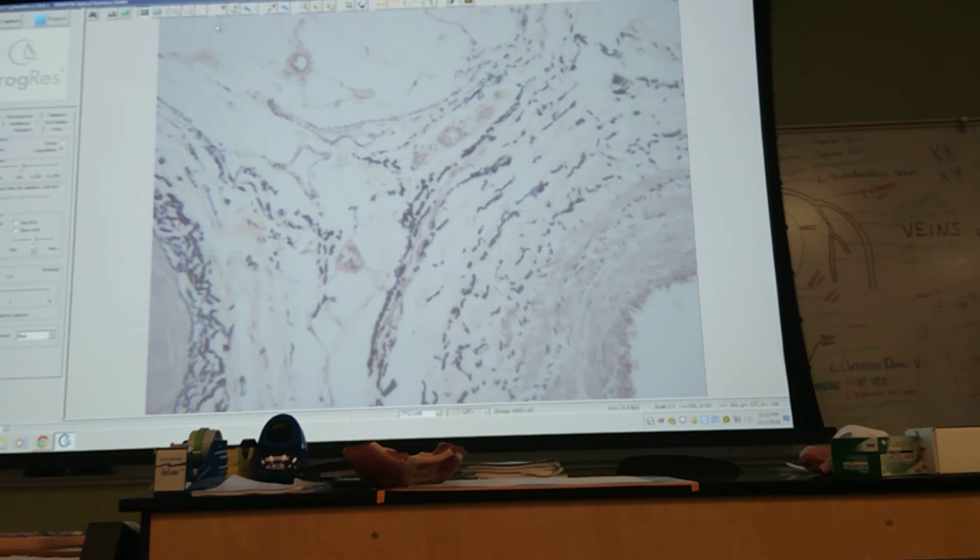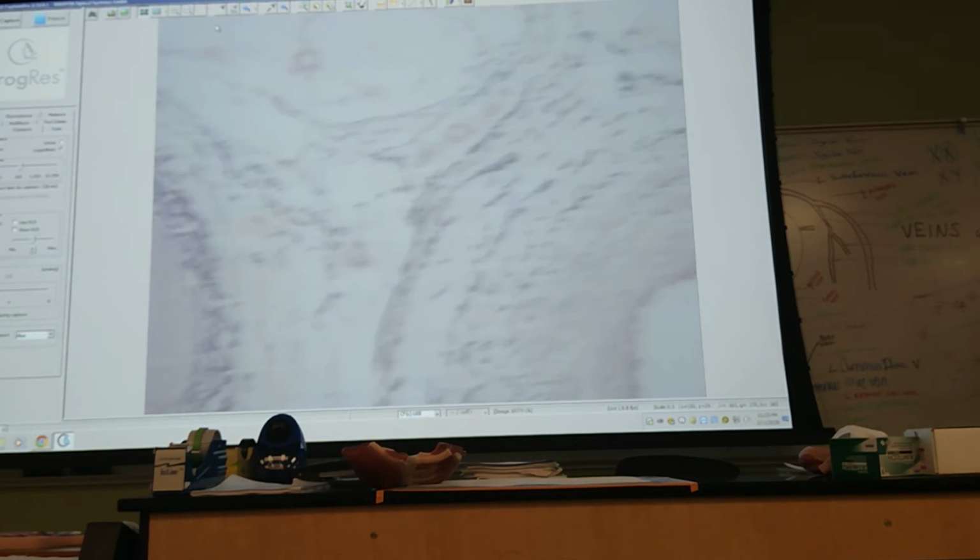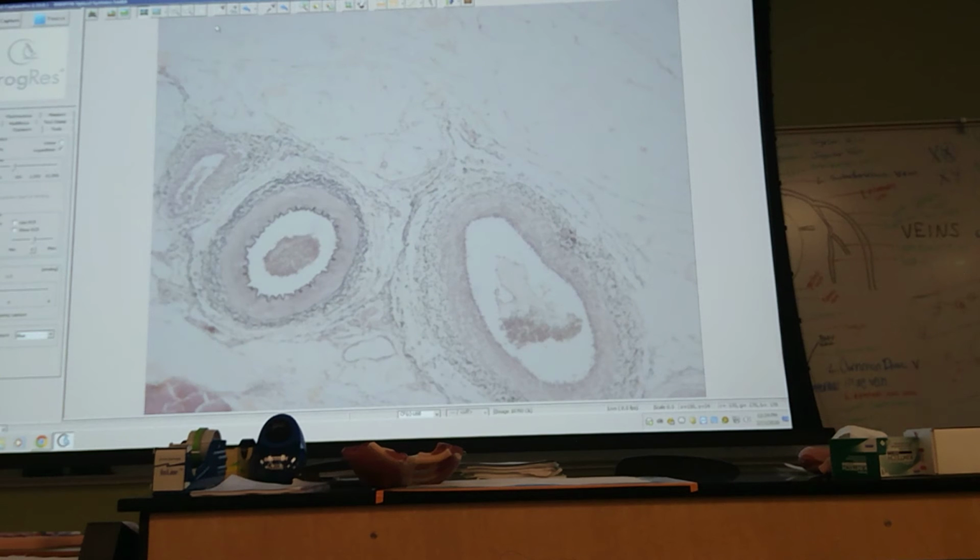Any questions on artery or vein? The layers: again, major or general, and specific or sublayer. They will use those terms. They often will just give you a picture. Identify this overall structure. Artery.